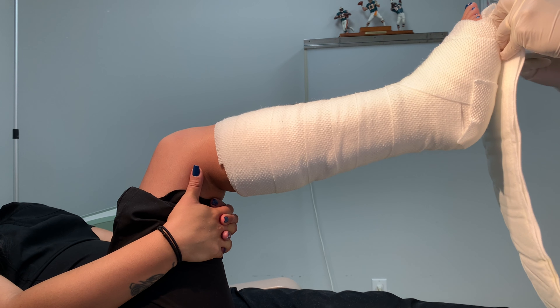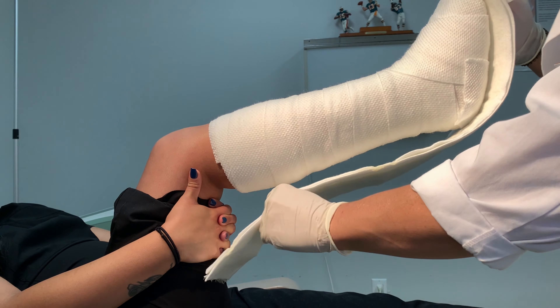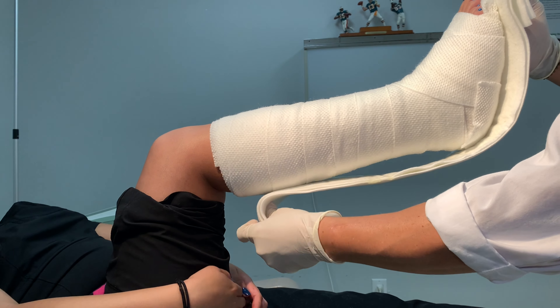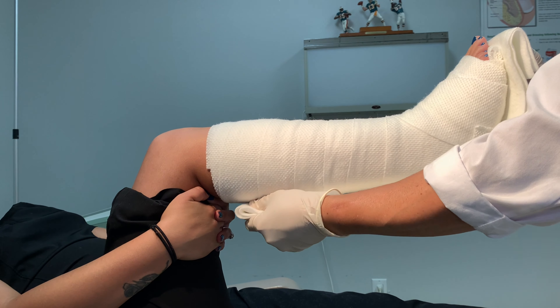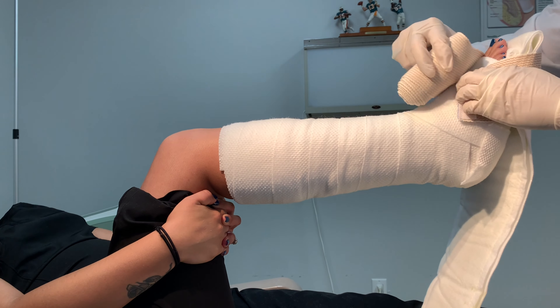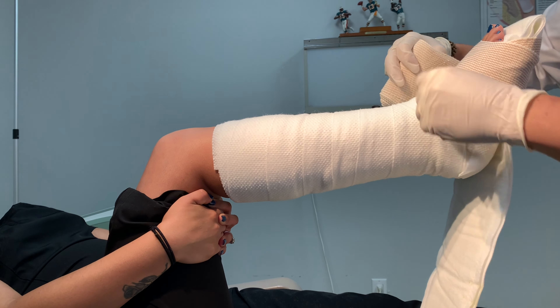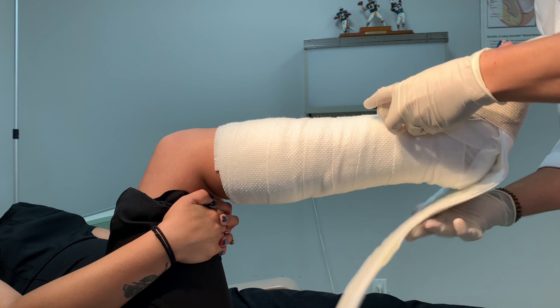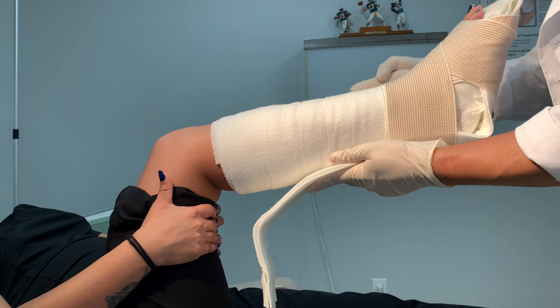We are now ready to apply the splint material. Be sure to keep reminding the patient to keep their ankle at 90 degrees and neutral, especially during this part of the splint. With the 30-40 inches of recently hydrated splint material, apply to the plantar foot with the splint material extending roughly 1 cm past the tip of the hallux after being folded.